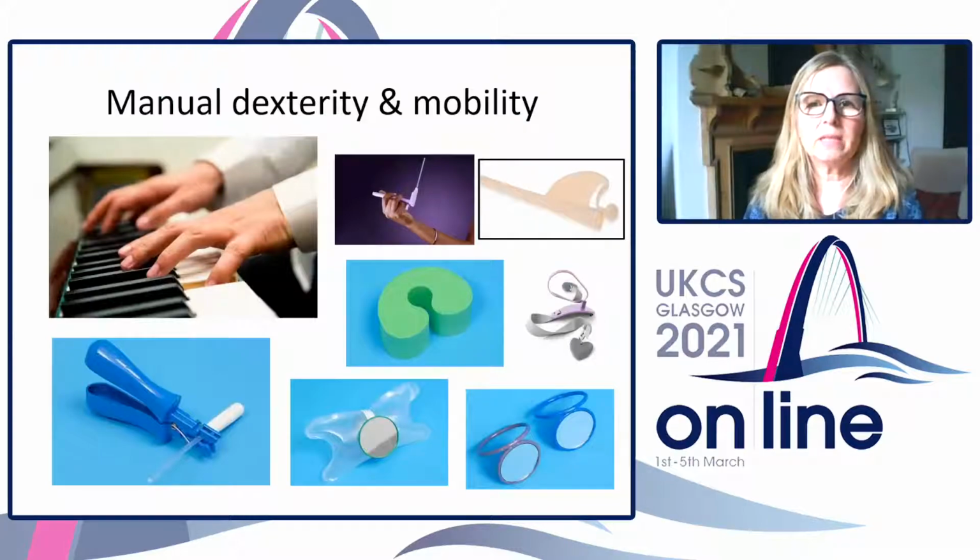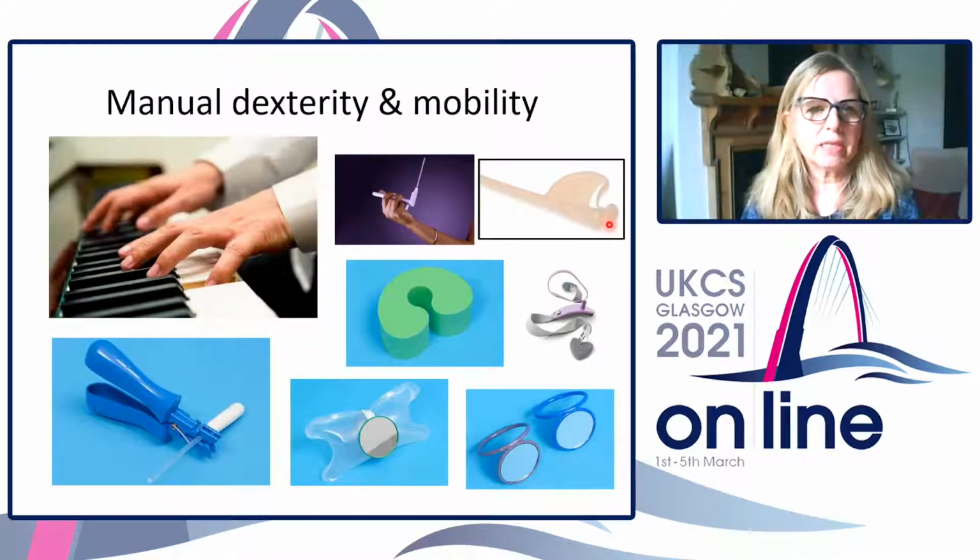Catheter designs have been developed to help people with the insertion procedure. For example, recently a catheter for women here with an integral handle, a catheter here with a pop-off lid to prevent drainage until the catheter is in position, and then a whole range of accessories which can be used by men and women to enable better access to the urethra.